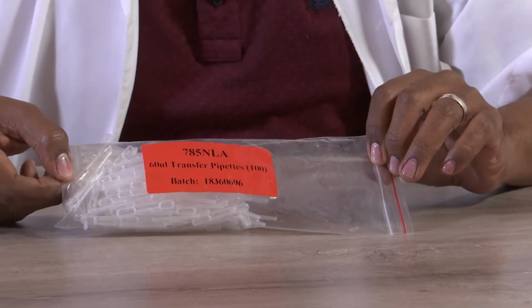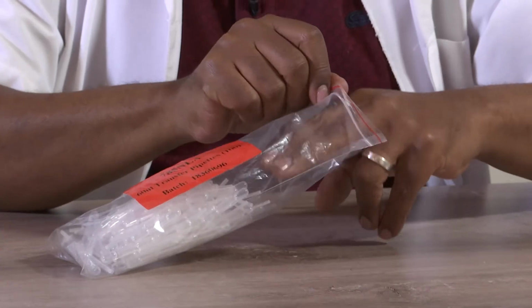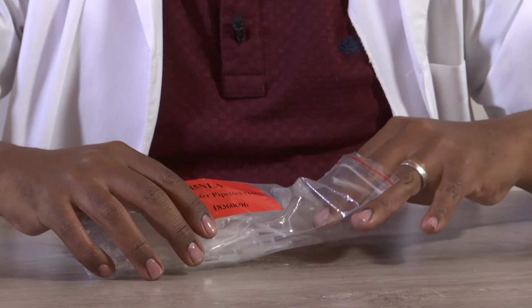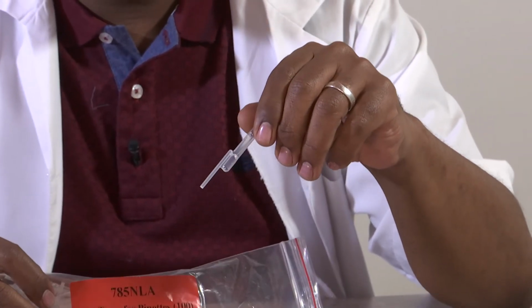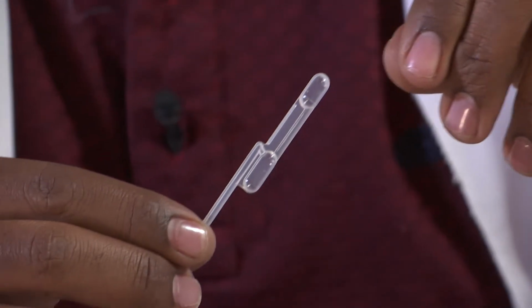You also have a 60 microliter pipette and 60 microliter tubes. They come as a separate package with the test kit but are not found in the testing kit. These can be replaced by disposable pipettes of similar volumes if you do not have the above mentioned. There are materials that are required but are not provided in the kit.